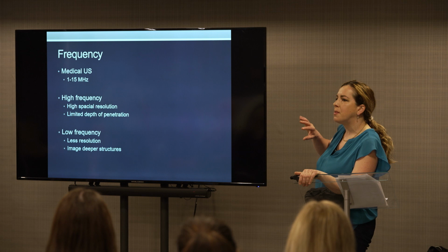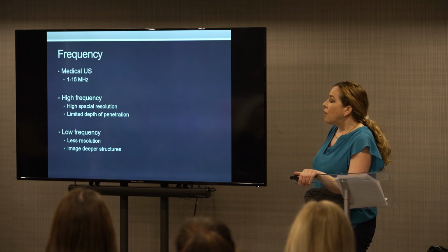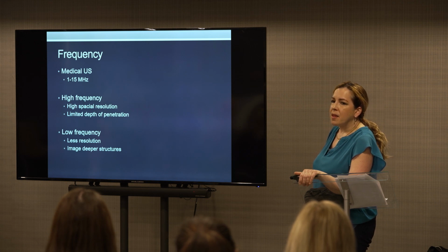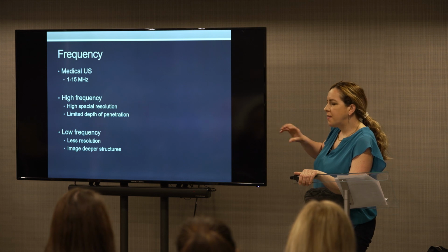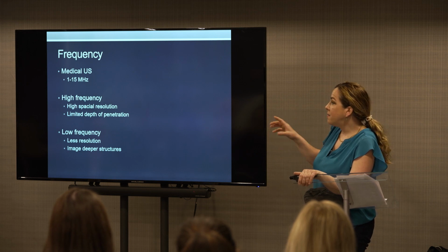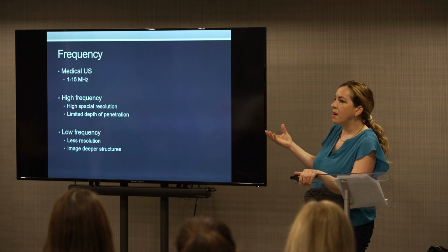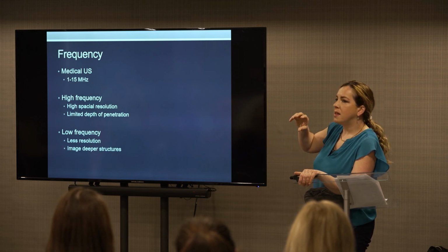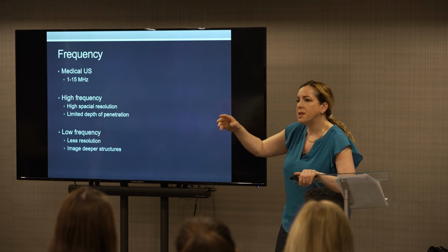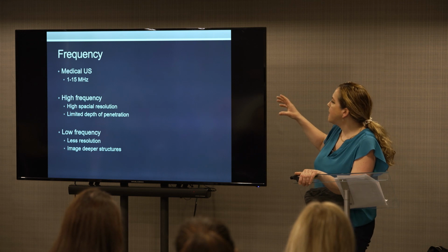So for neck ultrasound, we're at the top end of that. You can alter the frequency of your ultrasound beam on the machine. When I first started, you were changing numbers, so frequency, I don't know, 10 to 12 to 14. Now on the modern machines like these, you have a preset, for example, a thyroid preset, and then you might start at the general frequency and you can flip up to high frequency or flip down to greater penetration. So there's basically a trade-off.